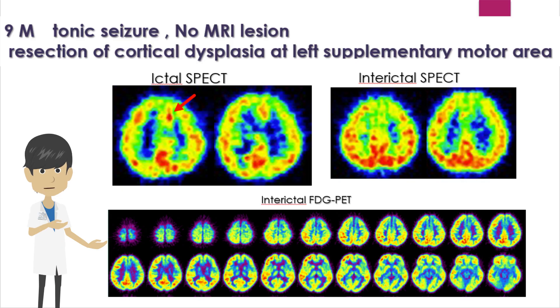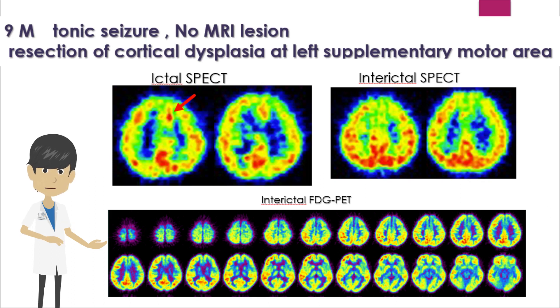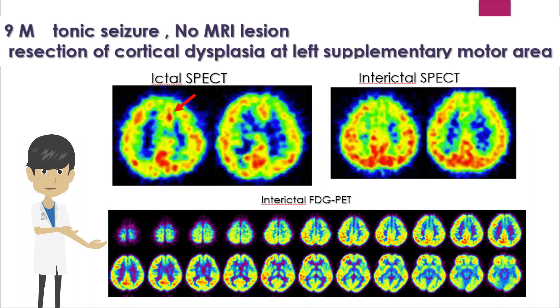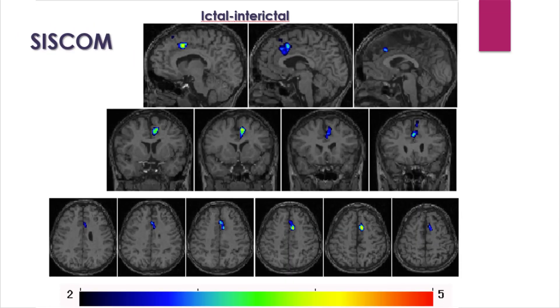This is a 9-year-old boy with supplementary motor area seizures, and the MRI showed no abnormalities. Ictal SPECT showed increased perfusion in the left supplementary motor area. FDG PET showed mild hypometabolism in a large area of the left frontal lobe. SISCOM shows increased perfusion localized to the left supplementary motor area. Epilepsy focal resection of this area was performed and the seizures resolved. Pathological findings confirmed focal cortical dysplasia.